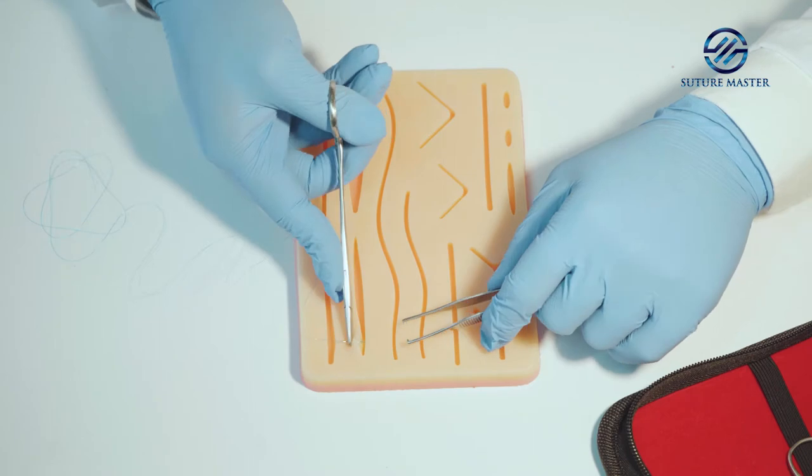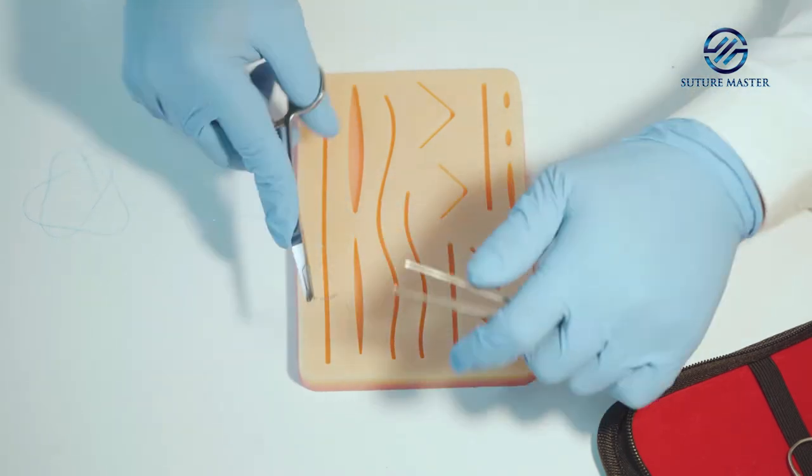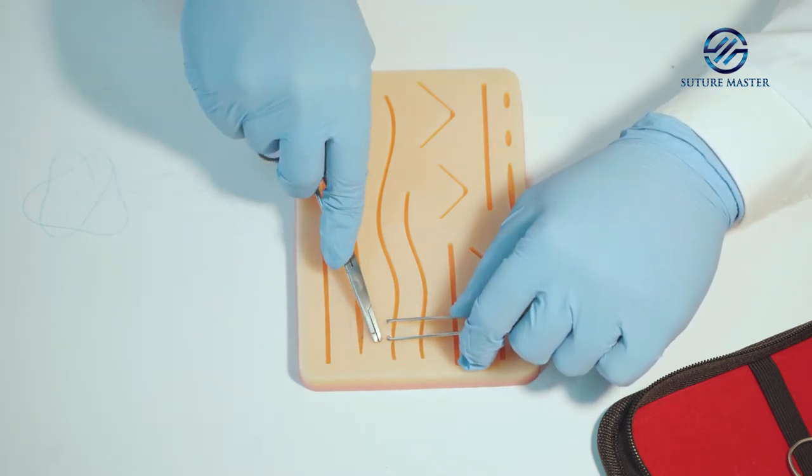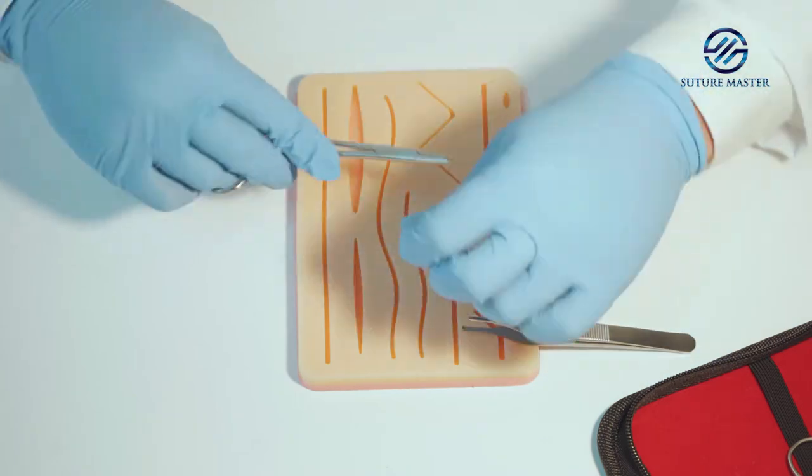Insert the needle 90 degrees to the skin. Should be around three to five millimeters away from the margin and three to five millimeters away from each other. Equal amount of tissues should be opposed on both sides.